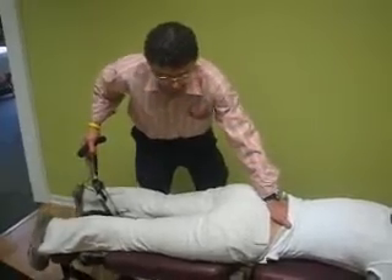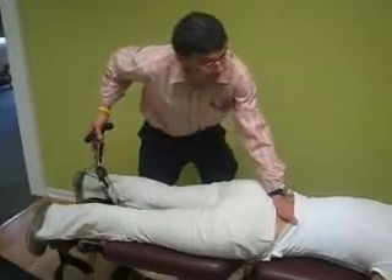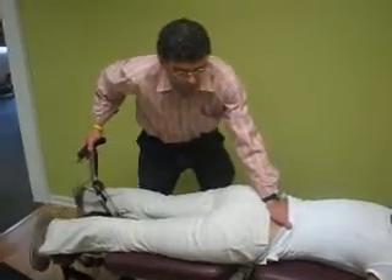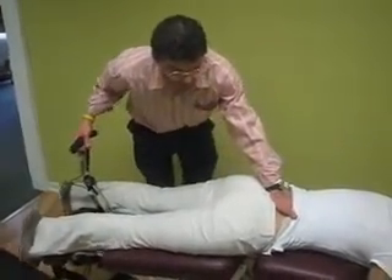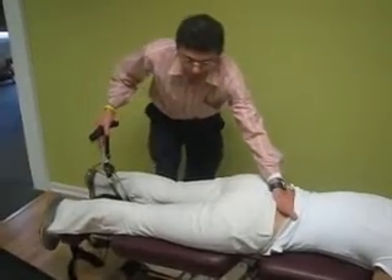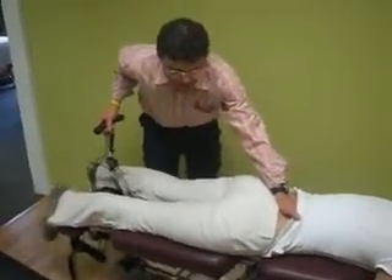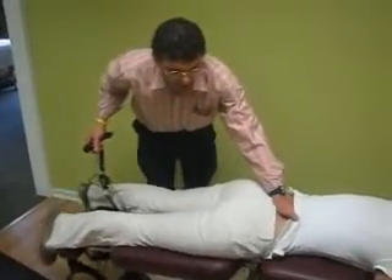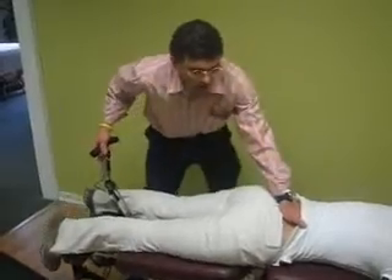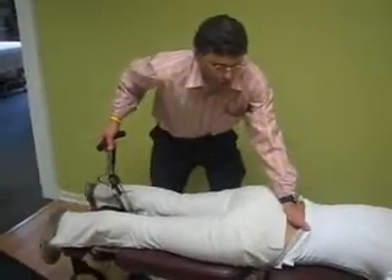So we're starting with flexion — we're going straight down just a little bit, and with my left hand I am pressing forward and down. With my right hand on the handle I'm just going down and up. We also move this into a lateral position on both sides, left and right, and we can do what is called circumduction — it is like a figure eight. There are several joints of the bones of your spine and these move or articulate in different ranges, so we are moving the lower part of this table to stretch these different muscle groups in order to relieve the amount of compression.